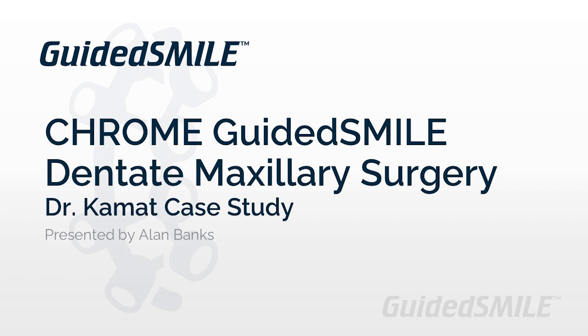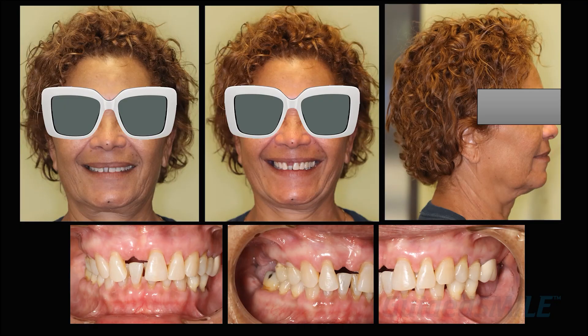This case documentation covers a guided full-arch maxillary dentate case using the Implant Direct implant system and their guided kit. The records on this case were pretty straightforward — the patient has a lot of teeth, therefore a good stable habitual bite. We have the normal photographs: very nice work here, retracted in occlusion, left, right, center, and then a full face and full smile.